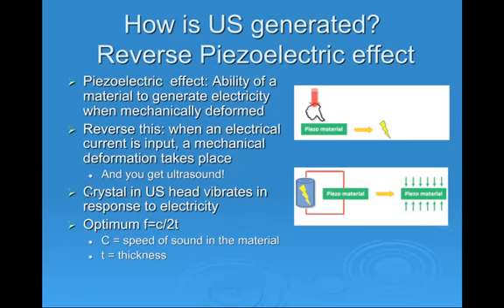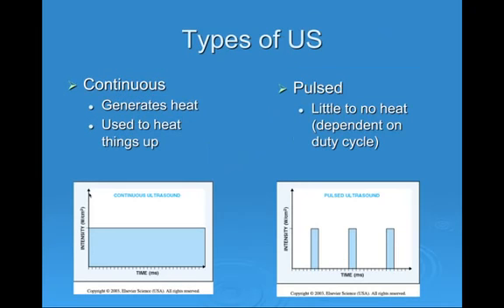the time on our machines from 1 to 3, and like I said, some machines have 2 megahertz. And so the manufacturers have made some compromises here in order to produce an ultrasound machine that can perform at more than one setting. All right, so I've already alluded to 2 ways that we'll typically use ultrasound, and that's in a continuous mode and in a pulsed mode.